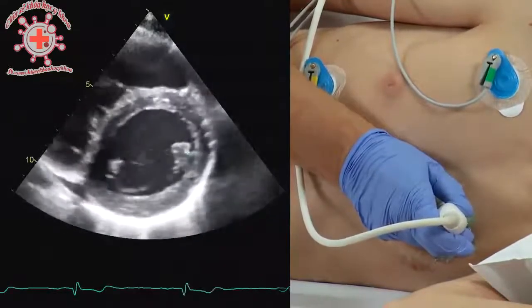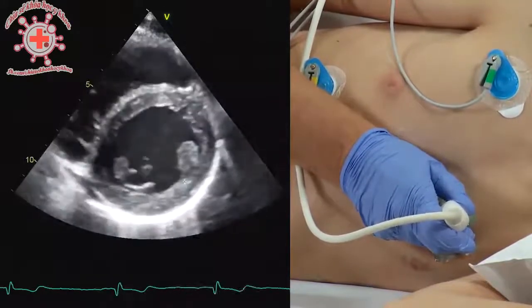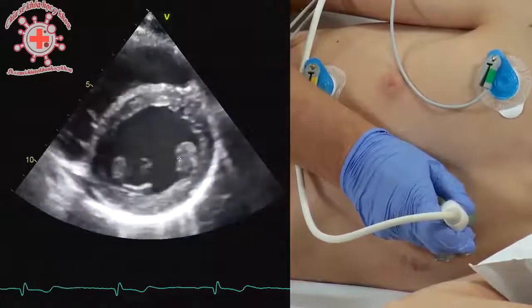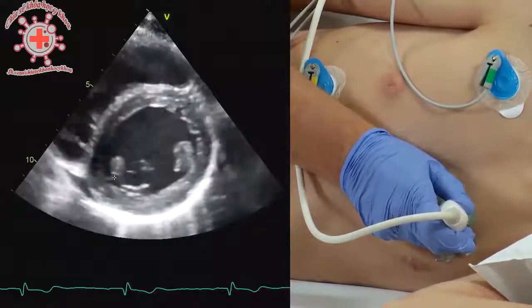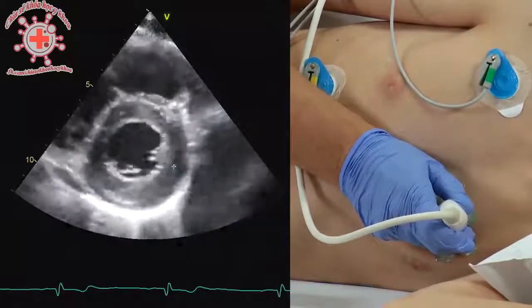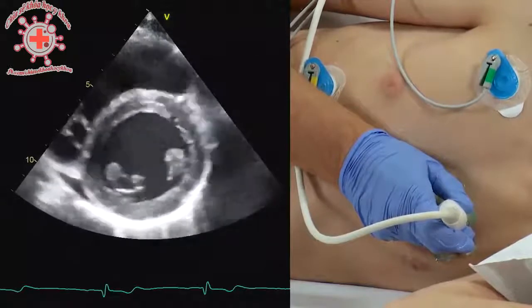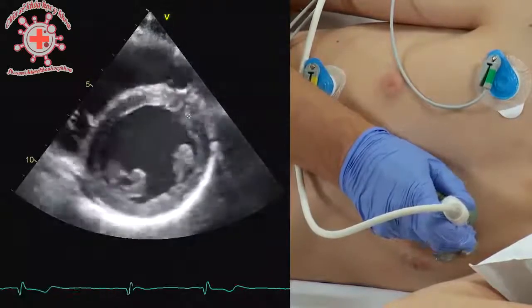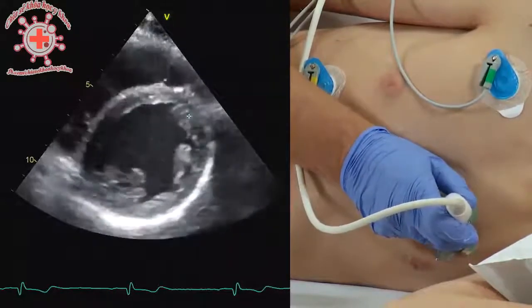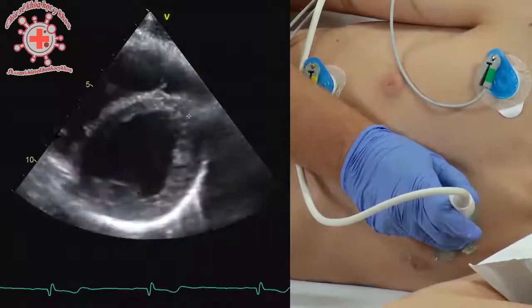This is the papillary muscle. The further down you go, the more you will see the attachment of the papillary muscle with the wall. One muscle is here, here's the other one. You can nicely appreciate here the pericardium, which is the very echodense structure. Then you tilt downwards and look what happens to the size of the left ventricle. You see it gets smaller and smaller.